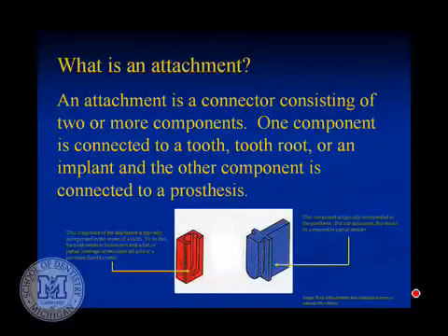Now, there is literally a plethora of attachments. For those of you that are grammatically challenged, plethora means a lot. So there are lots of different kinds of attachments. Having done these for years, my time frame on how long I want these things to last without a lot of maintenance issues on my part gets longer as I practice more. So to me, a 3 or 5 year time frame isn't long enough. I'm into 15 or 20 years, or 20 years plus. And if I have to do maintenance on them, the simpler the maintenance procedures are, the better.